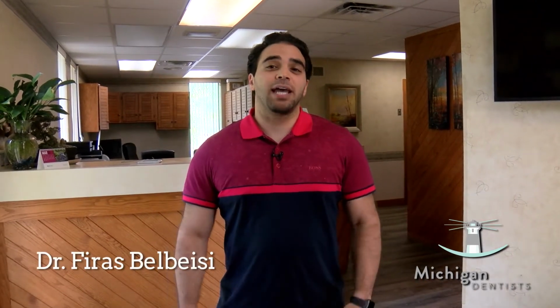Welcome to Michigan Dentist. I wanted to make this video today to show you guys what digital dentistry at our practice looks like. Today we're going to scan, mill, and cement a permanent crown on a model to show you what one-day crowns look like. Let's show you what that's like.